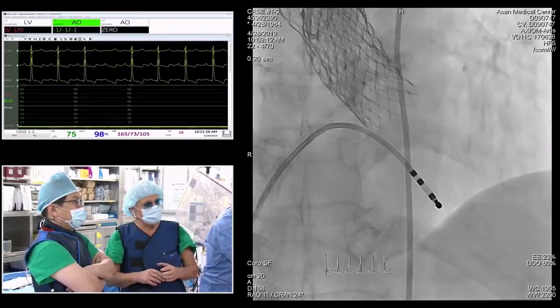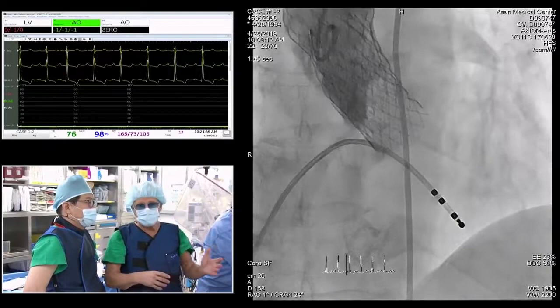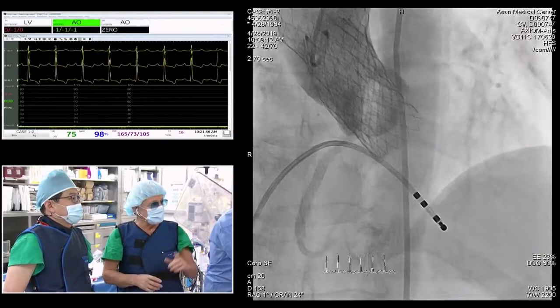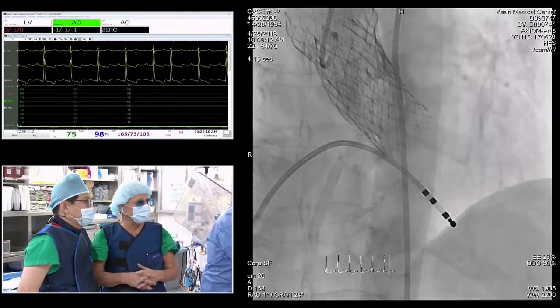The EKG looks good. Even though we wanted to show you the access, obviously that was the challenging question, due to contrast, time, and everything. So for the access, Dr. Arne decided to stop the procedure before we were able to get the access. But I can promise you, between the two, we were able to get through the struts and get in between the trough of the leaflet. So I'm hopeful and confident that we're able to get access to the coronaries.